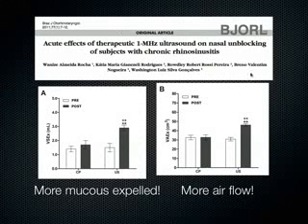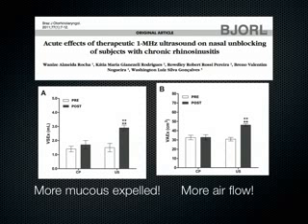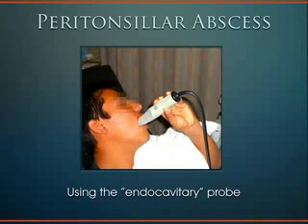A lot of this stuff requires, obviously, more research, but this is something that I found sort of intriguing when I first found out about this, that you can actually use ultrasound not just diagnostically with the sinus, but therapeutically as well. Switching gears, we're going to talk now about peritonsillar abscess.